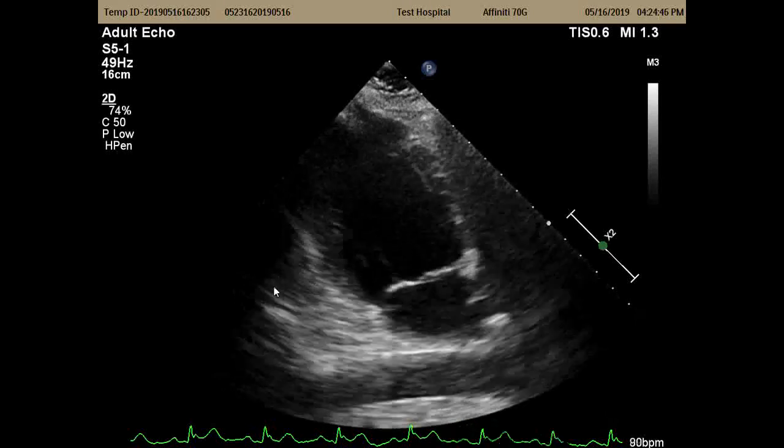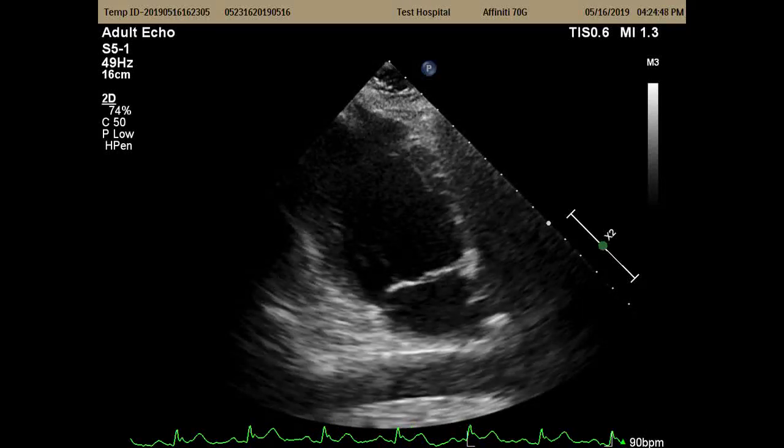We have our friend here called the Coumadin ridge. Right here, you see this little white line. People call that the Coumadin ridge because people will confuse it for an LA thrombus. That's a really good marker that your apical 2 chamber is on axis, that you're lined up, that you're looking at the true anterior wall to the right and the true inferior wall to the left.